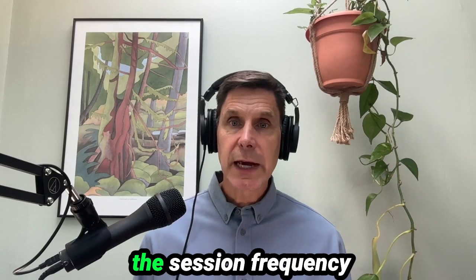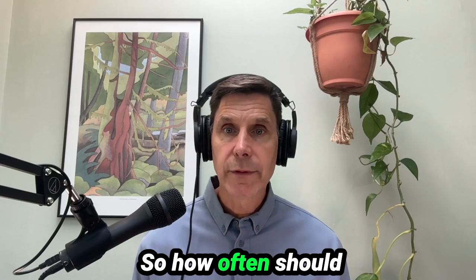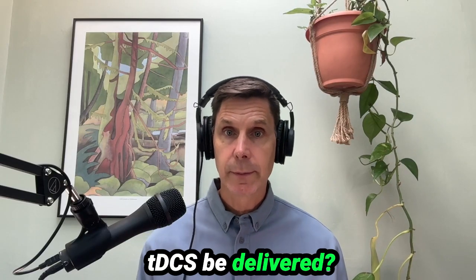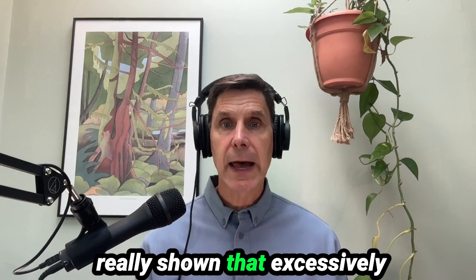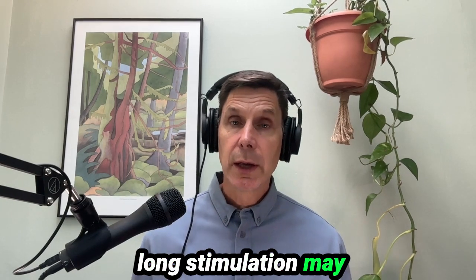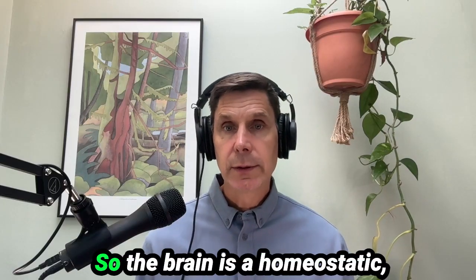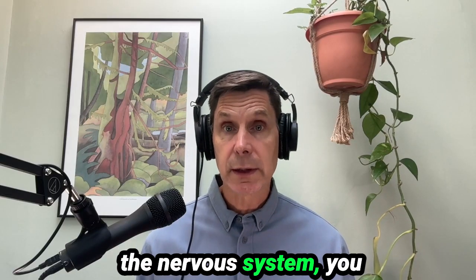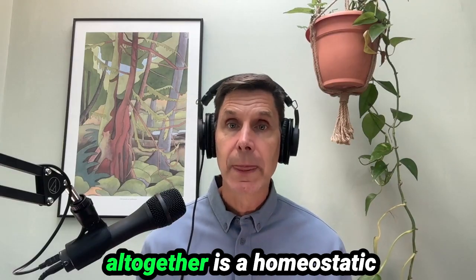Now let's have a look at the session frequency and repetition. So how often should tDCS be delivered? The old rule was longer is better, but research has really shown that excessively long stimulation may actually trigger homeostatic counter-regulation. So the brain, the nervous system altogether, and really you could expand that to say that the body altogether is a homeostatic system.